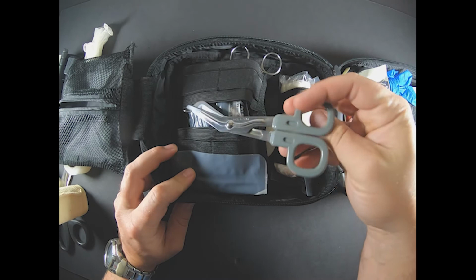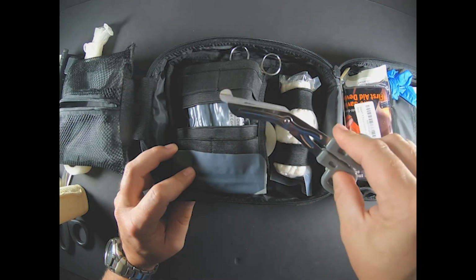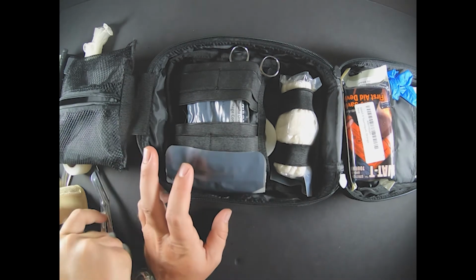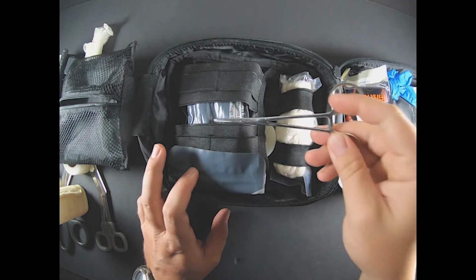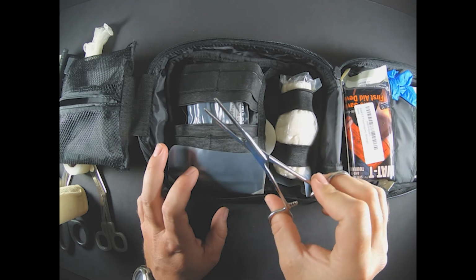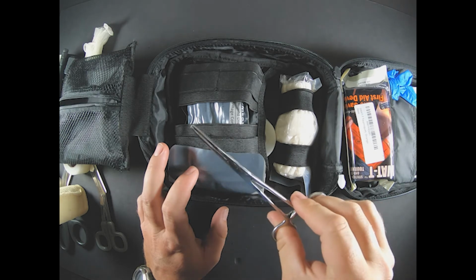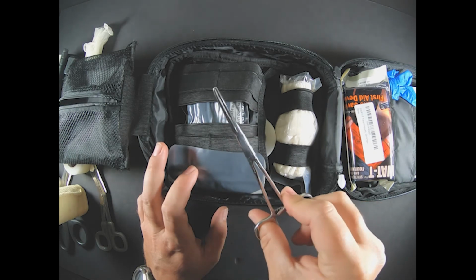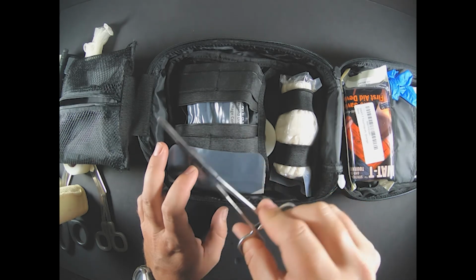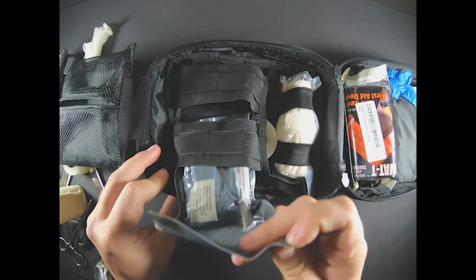Do you have another set of trauma shears in here? It's a smaller set, just as a secondary backup. A pair of hemostats. You never really know what you'll need these for. They can come into many uses for many different things, and if you're not trained on most of the things in here, obviously you're probably going to want to take a class to learn all these things.